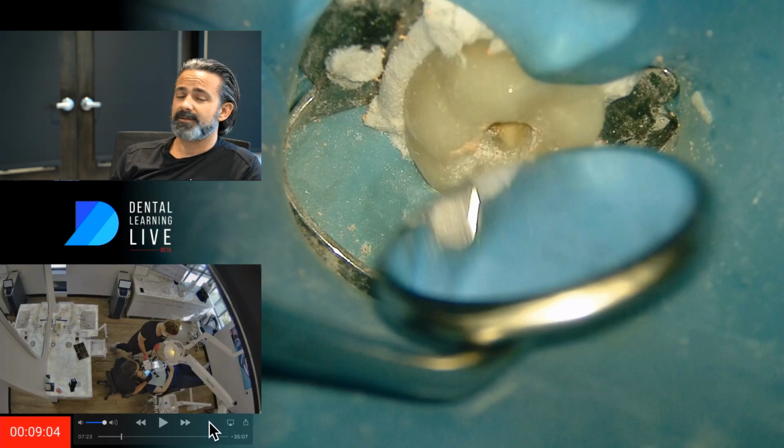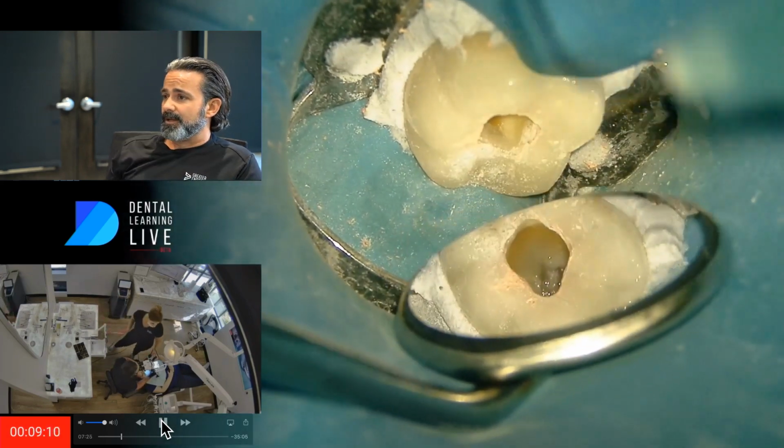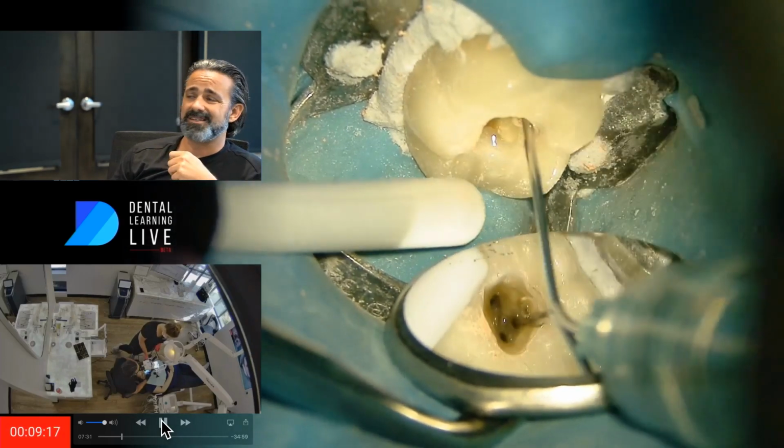So you paused it, Mike? What he did is he just moved over the time clock so you can see the time clock going. We're 9 minutes into this case.